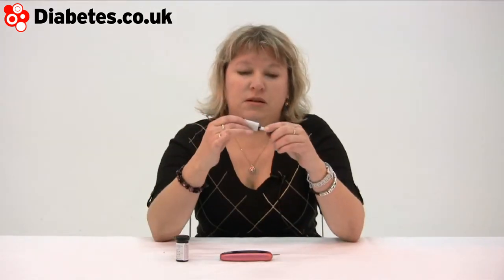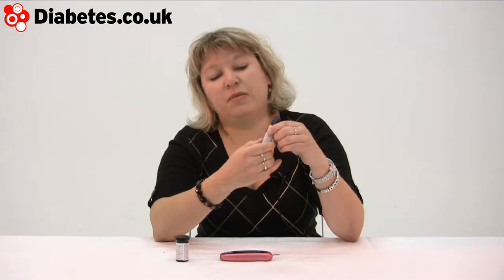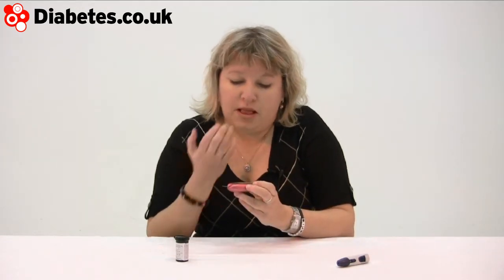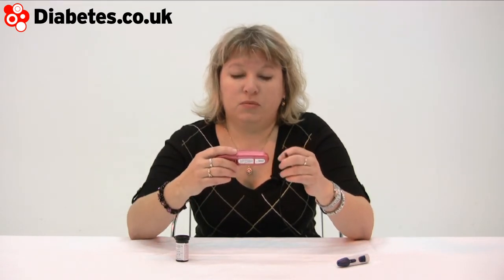The lancing device that comes with the model — you can adjust the depth like that, then you prime it and release like that. I've already got my strip in the meter; it counts down in five seconds, small amount of blood, and that's your result just like that. It can store up to 500 results, which you can download on computer and then work with using the OneTouch software, so you can see patterns and results.